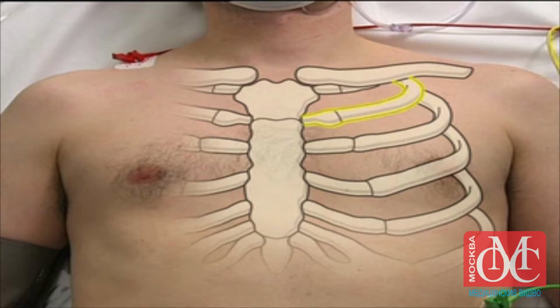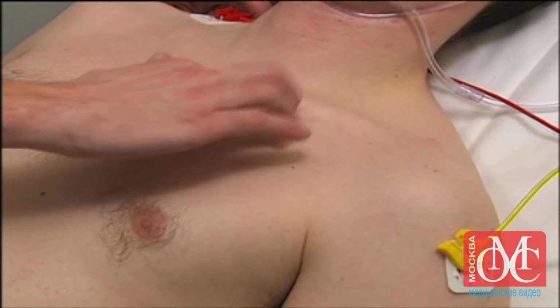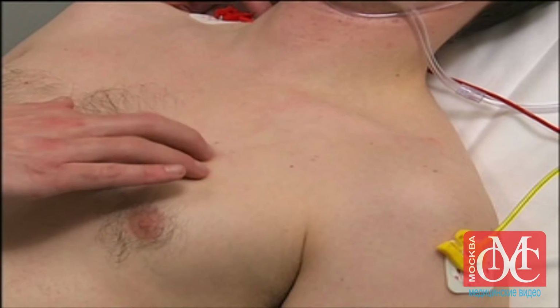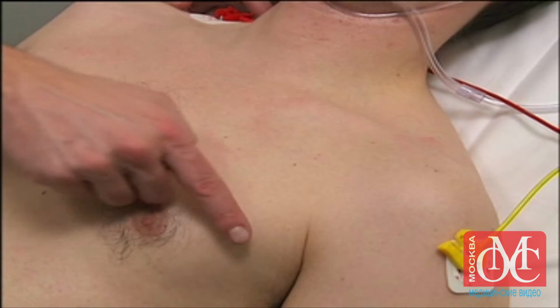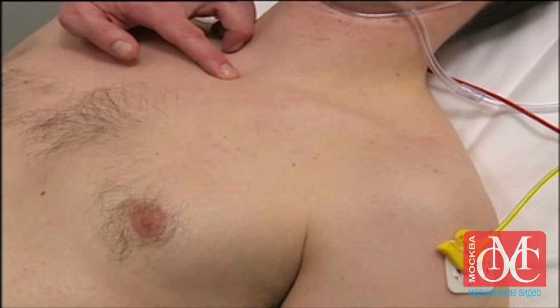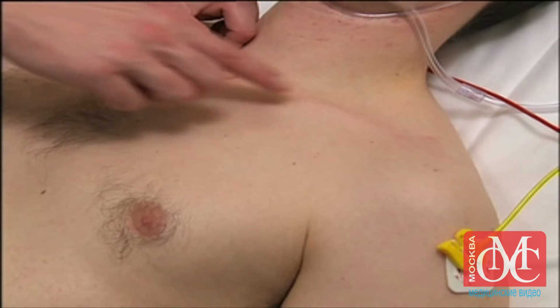Begin by locating the second and third ribs. The second rib is the first palpable rib that can be felt just below the collarbone. Then locate the third rib. The second intercostal space is the area between the second and third ribs. Next, identify the middle of the clavicle and the midclavicular line.